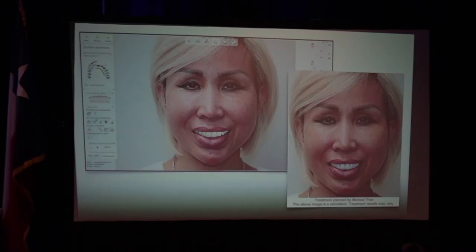I would send this photo in the future and say, hey, this is what the patient accepted, design it like this, because that design that I got back was too manly. I'm communicating. That's the benefit of a digital design process. You get the picture back, and you're like, hey, I don't like that. Round these edges, round these corners, make it a little, and I censor that, and she's like, I can't read your damn mind. You should have sent that to me in the first place, and it would have been easier. So communication is key.